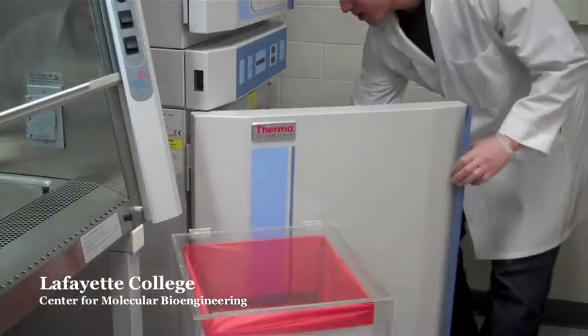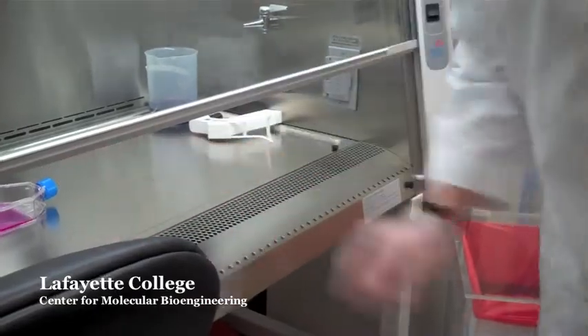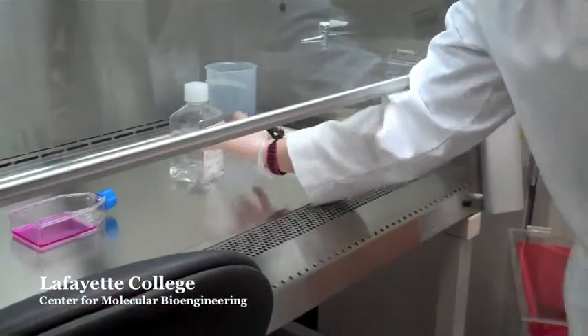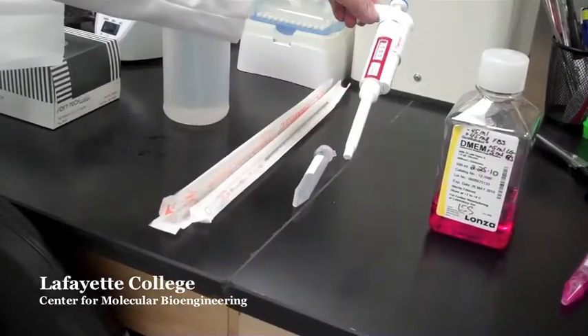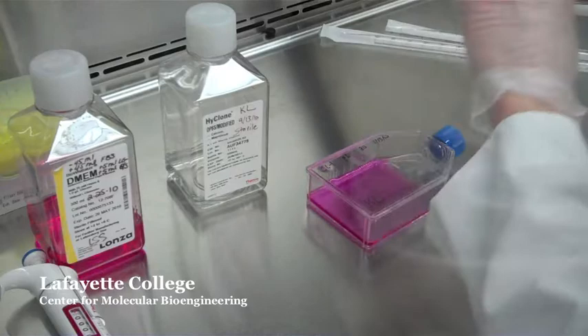Take out the T75 flask from the incubator and place it inside the hood. Take out a bottle of sterile PBS and spray it with isopropyl alcohol before placing it inside the hood. You will also need 3 10 mil pipettes, a 15 mil conical tube, a 1000 microliter pipetter, the bottle of warm media and the tube of trypsin. Spray all items and place inside the hood.